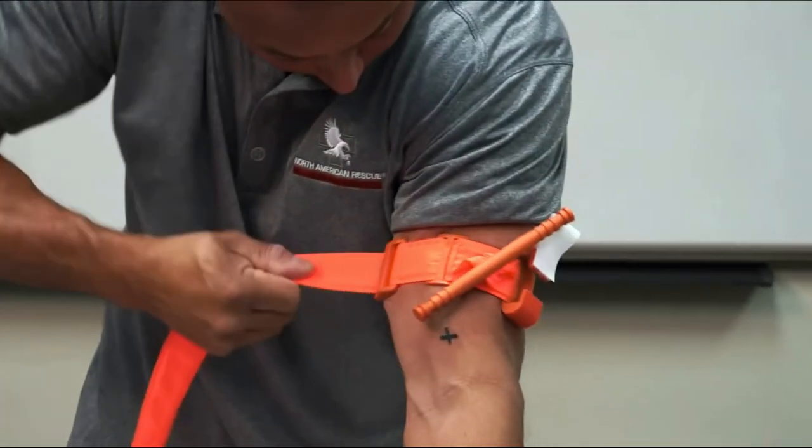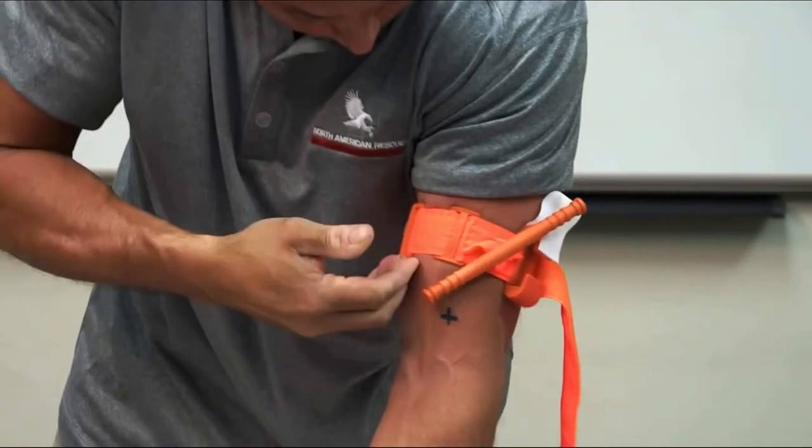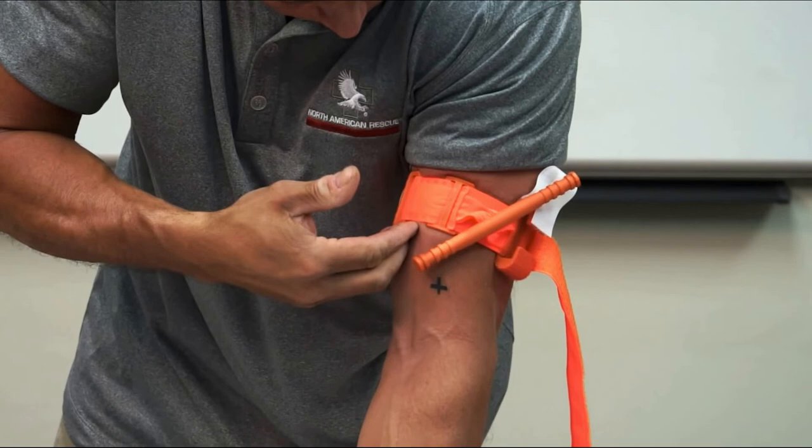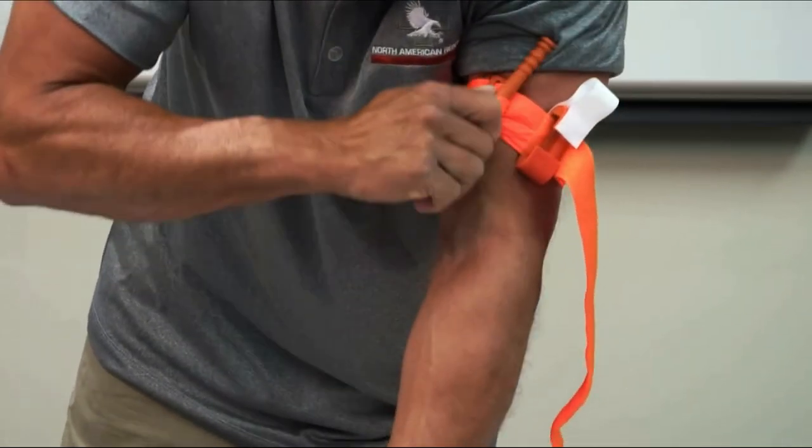Fasten it back onto itself, all the way around the limb, but not over the rod clips. The band should be tight enough that the tips of three fingers cannot slide between the band and the limb. If the tips of three fingers slide under the band, re-tighten and re-secure. Twist the rod until bleeding has stopped.